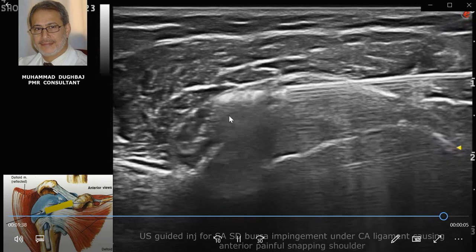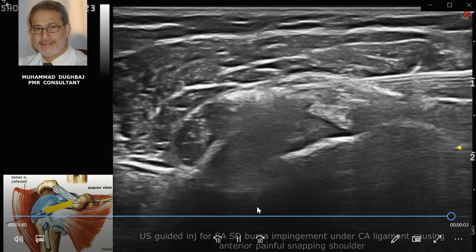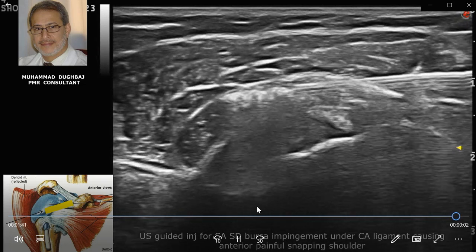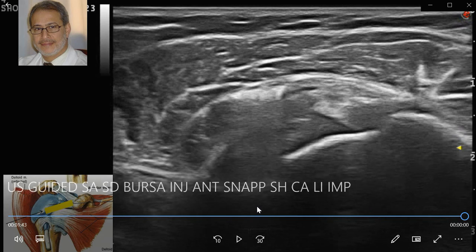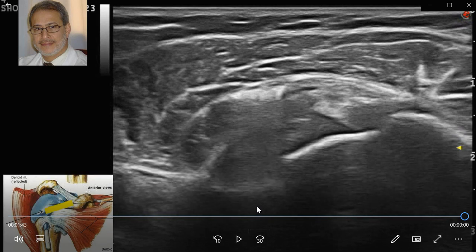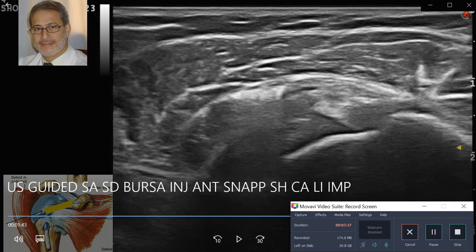You can see the distension of the bursa with the injectate. This demonstrates a successful dynamic ultrasound showing the cause of impingement — which is under the coracoacromial ligament — and the ultrasound-guided treatment for the impingement.